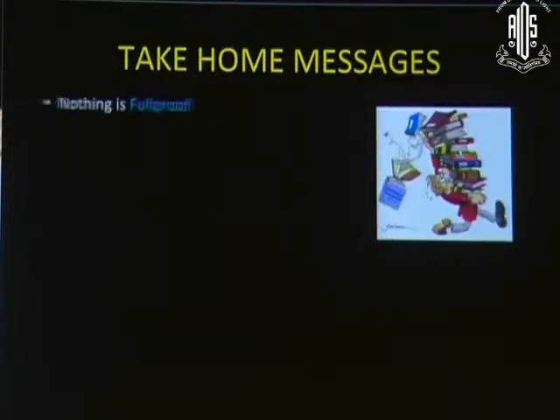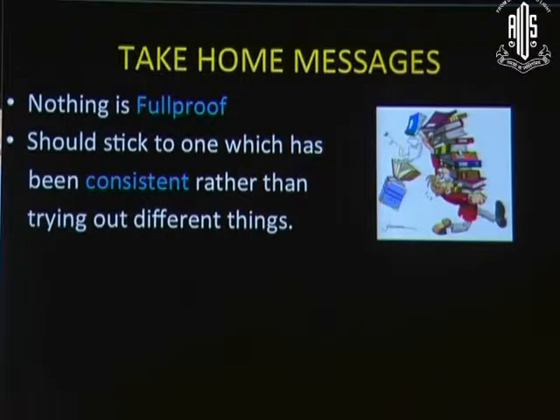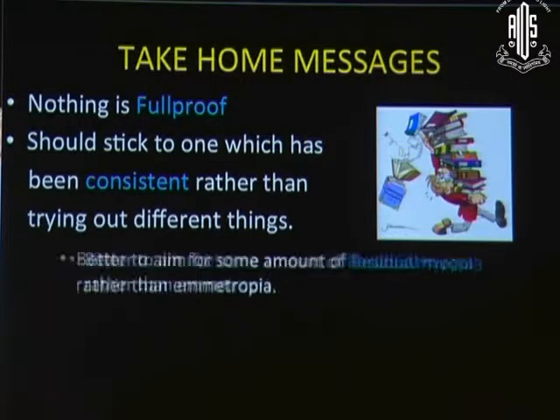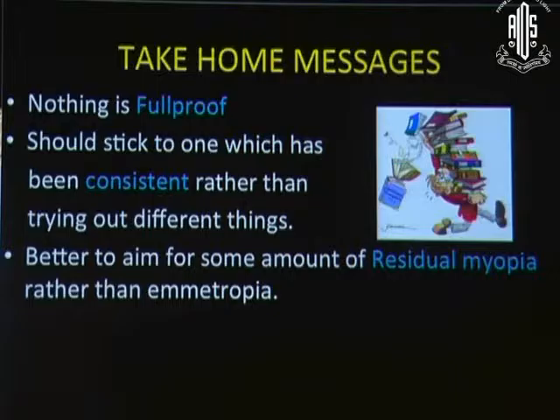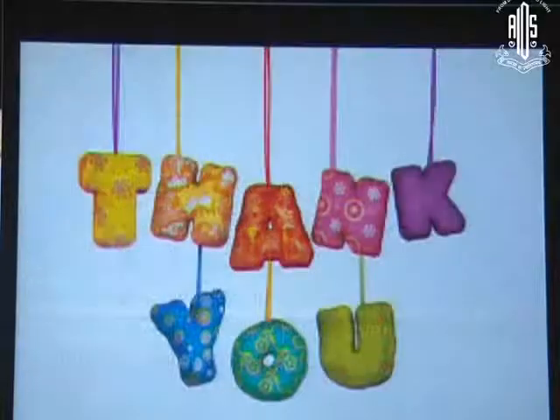So the take-home messages for these patients of refractive surgery: nothing is foolproof. We should be consistent. Let's not try out too many different things. Let us aim at a little bit of residual myopia and proper counseling of the patient for an eventuality of an IOL explant and re-implant or a piggyback.